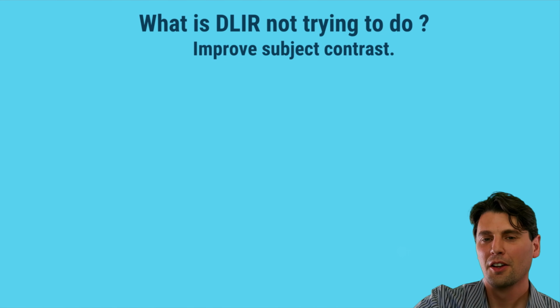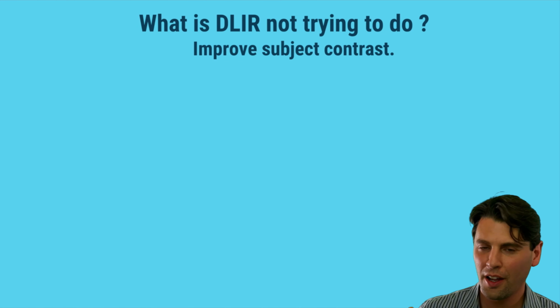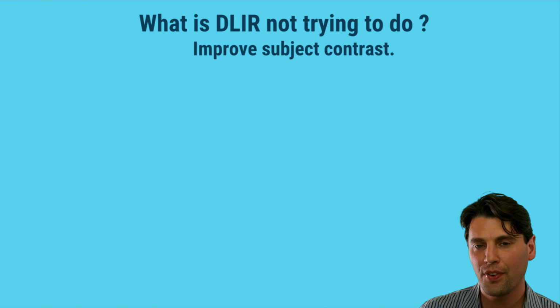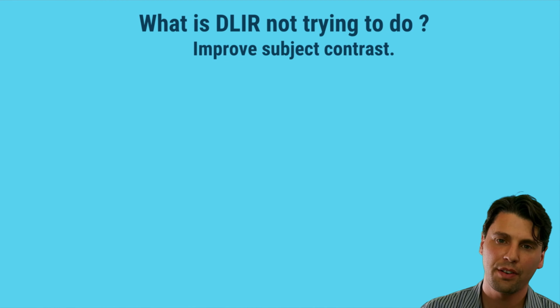So in summary, we just want to point out first, again, we're not saying that we have a network that's doing everything. And one thing the network is not trying to do is change the image contrast. We do have some features wherein there is the option as a user to do some small modification of the image contrast.